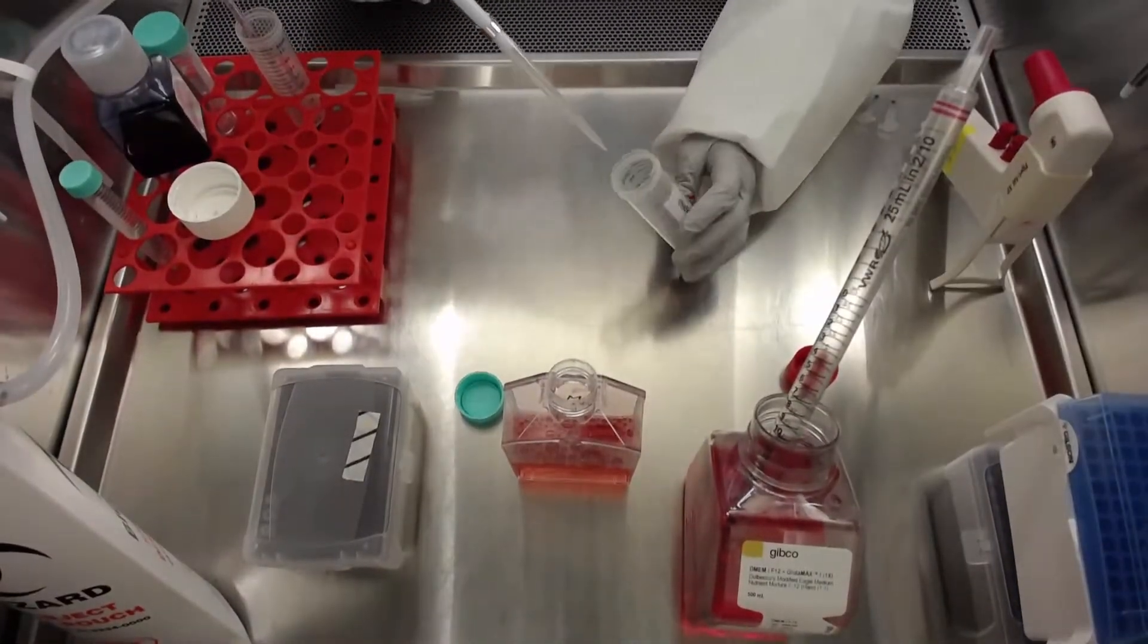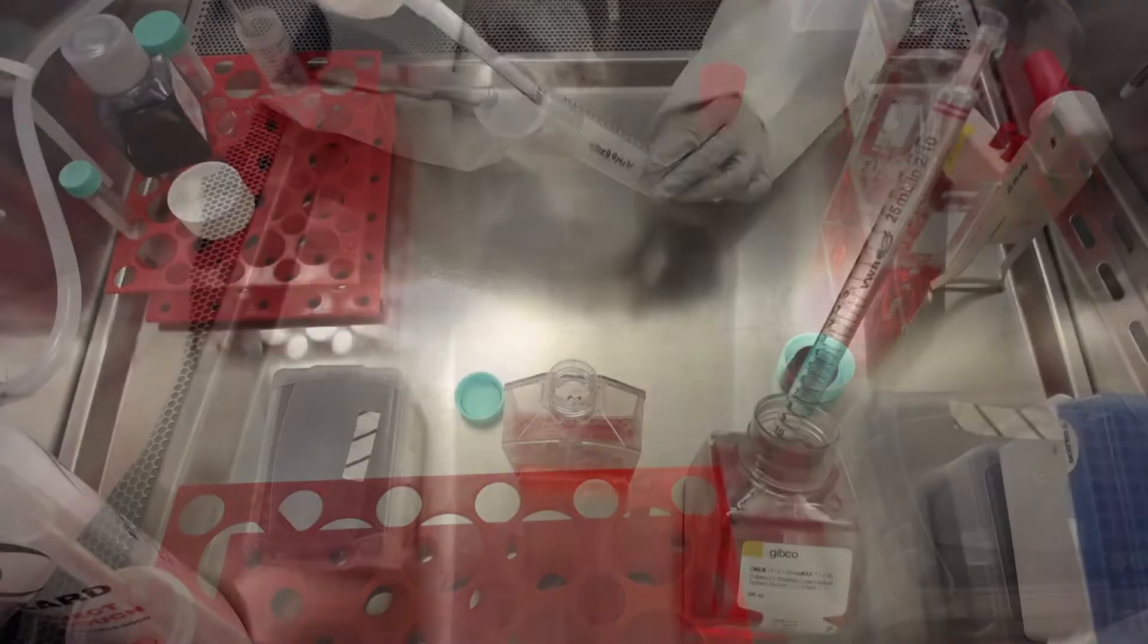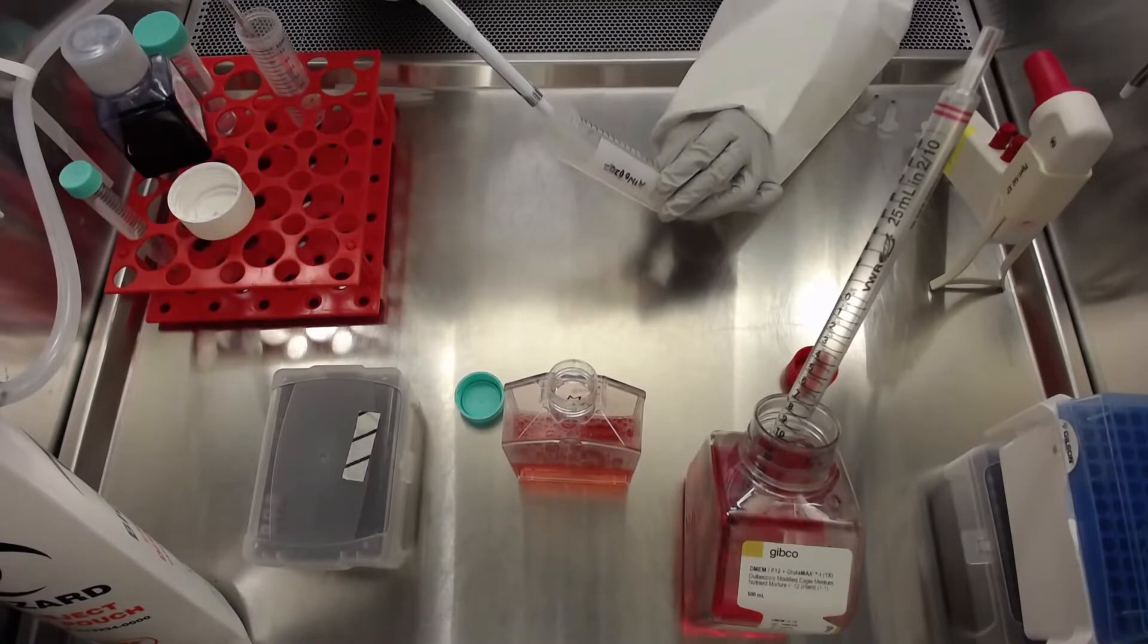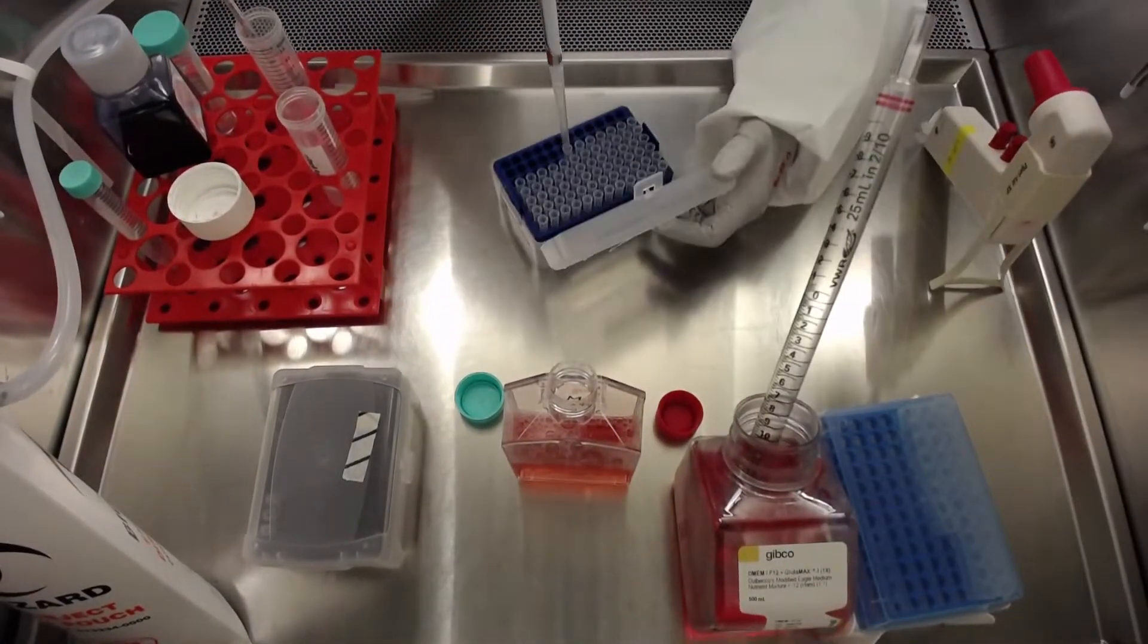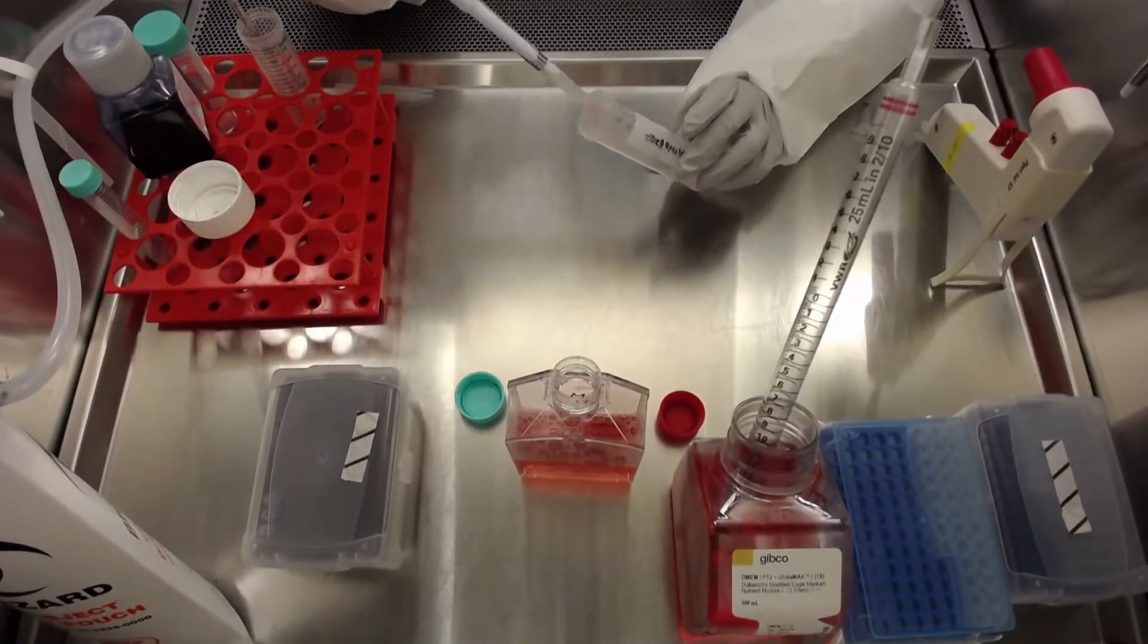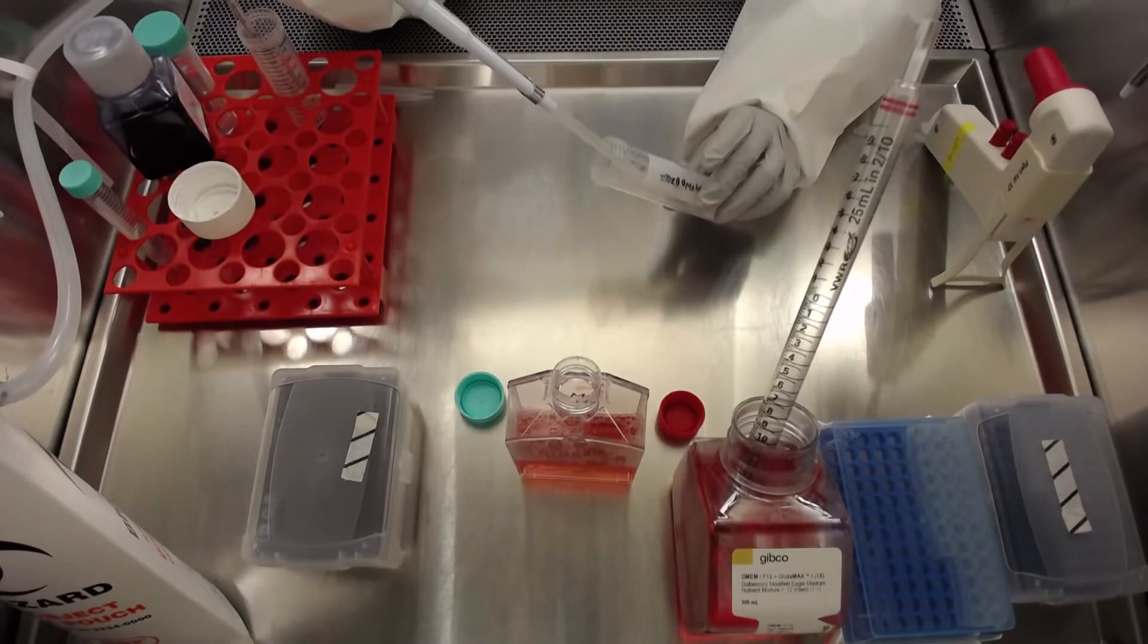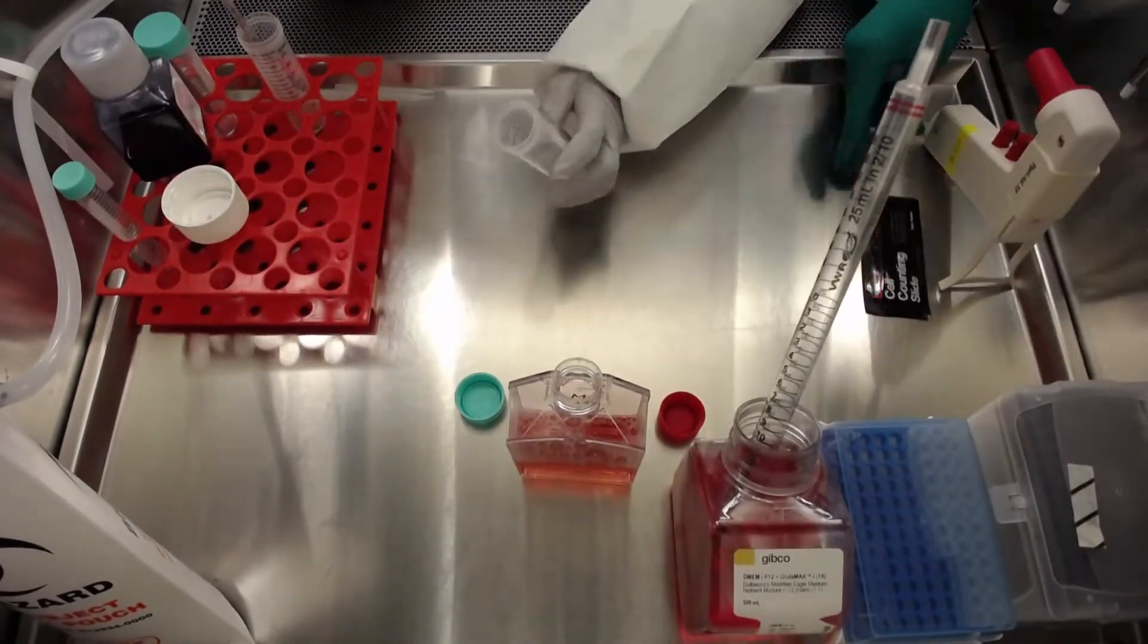To create a single cell suspension, add 1 milliliter of neuronal induction media with rock inhibitor, and re-suspend the pellet up and down, first by using a 5 milliliter serological pipette, then a 1 milliliter tip to continue the process, and finally, a 200 microliter tip placed on top of a 1 milliliter tip. It is crucial to seed single cells at this step to get uniform EBs later on. You should take as much time as needed to carefully make a single cell suspension.